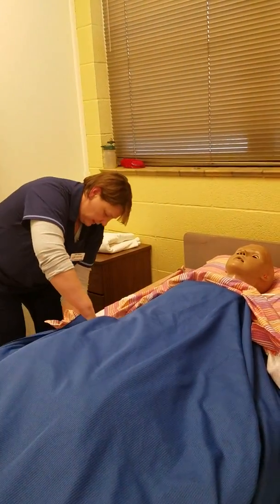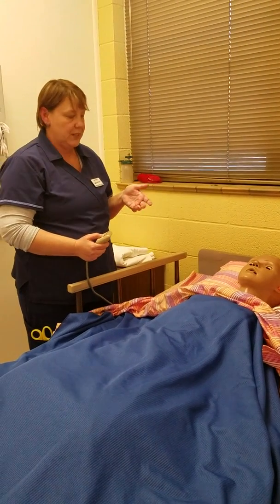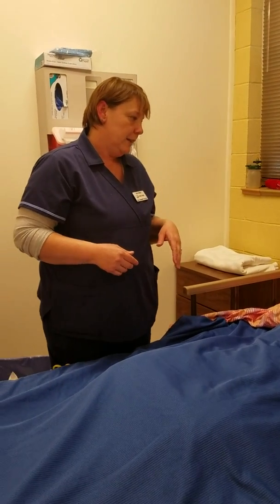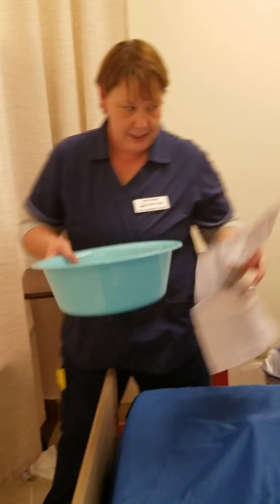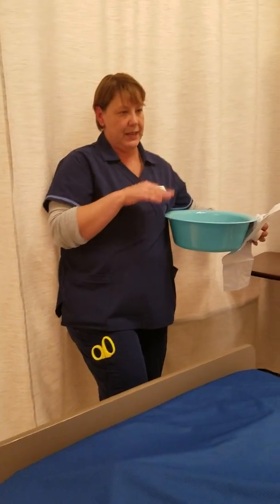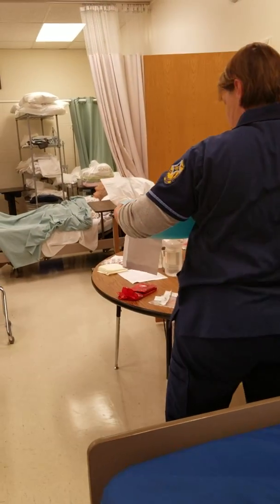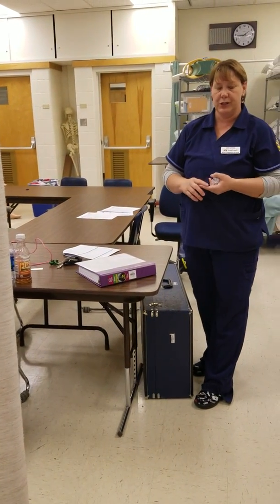I'm going to teach him a little bit about catheter care. Jose, the catheter's in there and it might be a little uncomfortable, but try not to tug on it — that's not good. I'll send your family back in and let the doctor know the catheter is inserted. I'm going to grab my remaining supplies, lower the bed, put up the handrail, and make sure he has his call bell. Then I'll exit the room and let his family come back in. From here I'm going to document that I completed the procedure, that the catheter is in, that I put 10 cc's of saline into the balloon — so they know to remove 10 cc's when taking the catheter out — that the patient tolerated the procedure well, and that urine is flowing nicely.